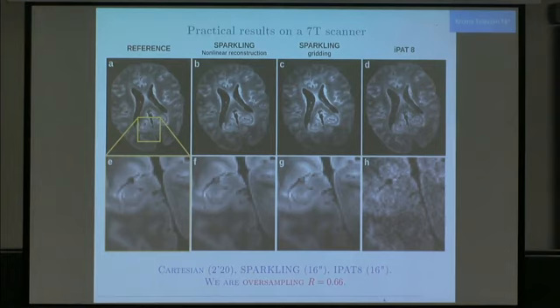Here we also compared with something the manufacturer provides, which is a GRAPPA sequence, for specialists. It also takes 16 seconds, but here the quality is definitely not the same. You cannot use this. So by basically doing oversampling, you can very strongly reduce the scanning times. And that's something quite surprising somehow.